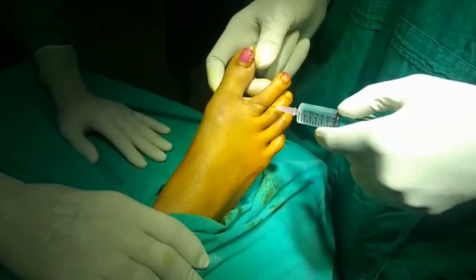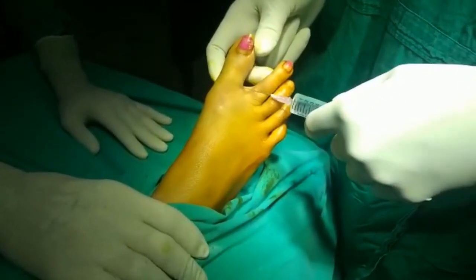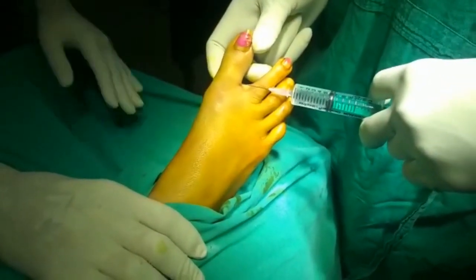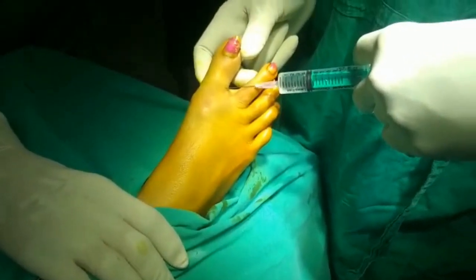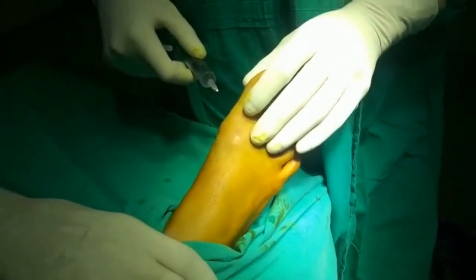This is a ring block which is given on the dorsal aspect. The same is repeated for the plantar aspect.